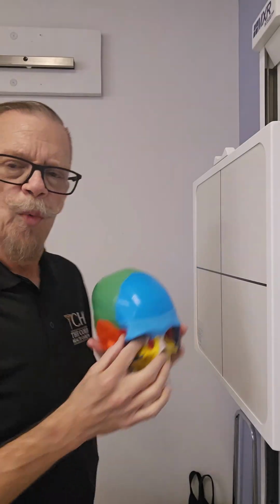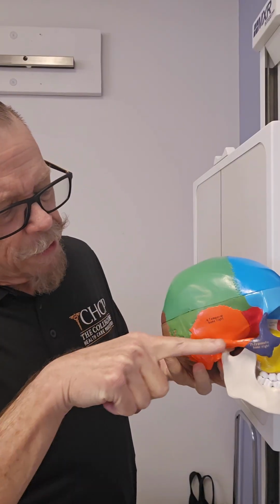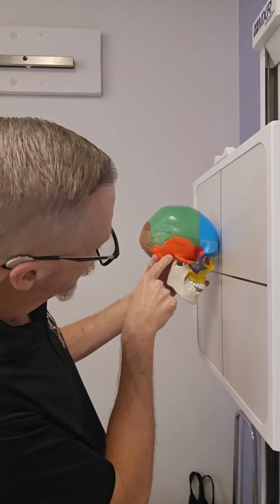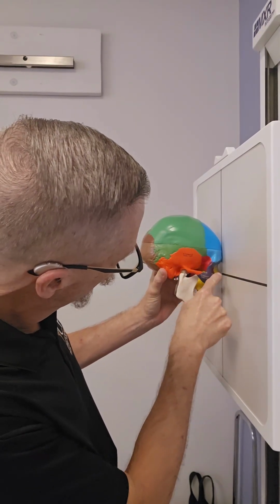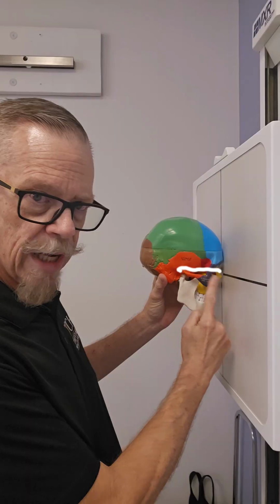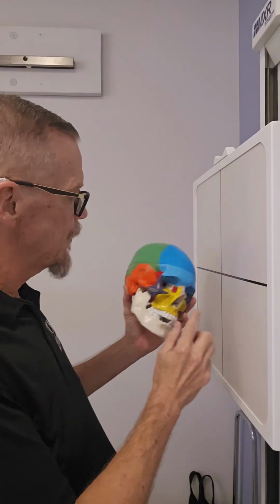When we talk about the OML, the orbital meatal line, that's basically a line from the mid-orbit to the EAM. So if that was perpendicular, it's a little hard to tell with this, but right about there. I'm going to try to show a little line. Look at this little line right here. See how that's perpendicular? So that's the OML.